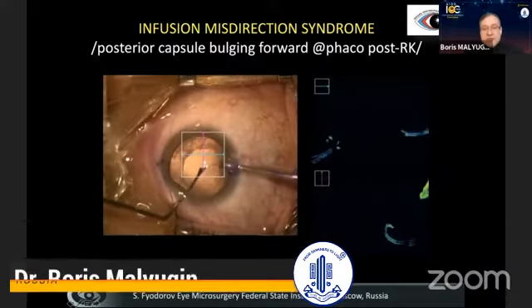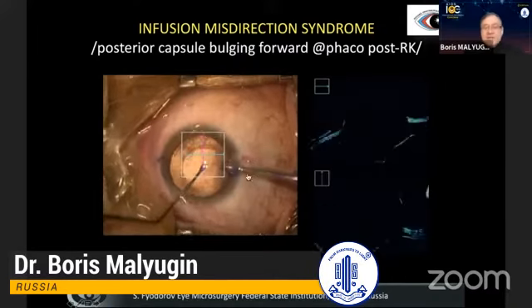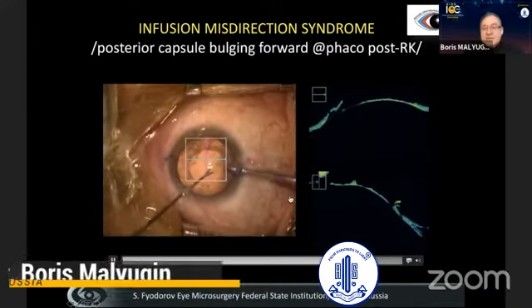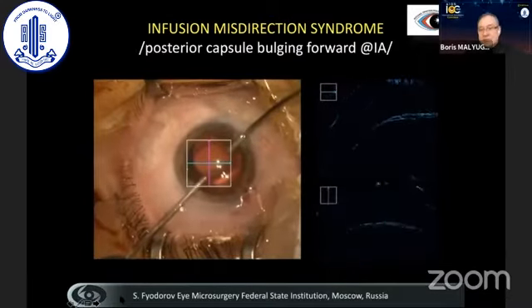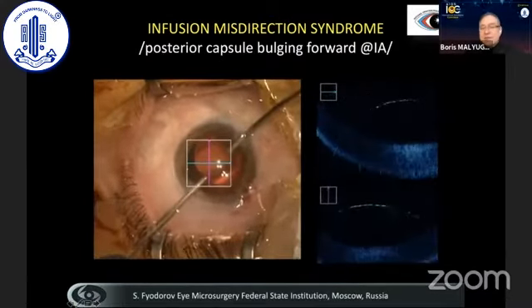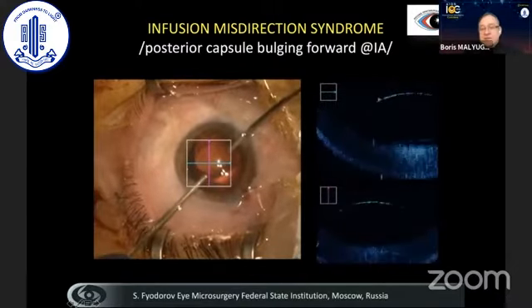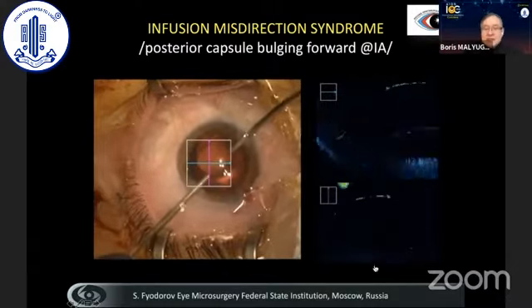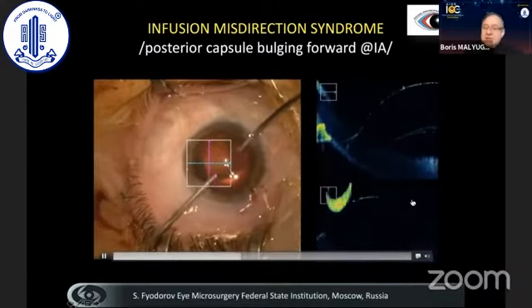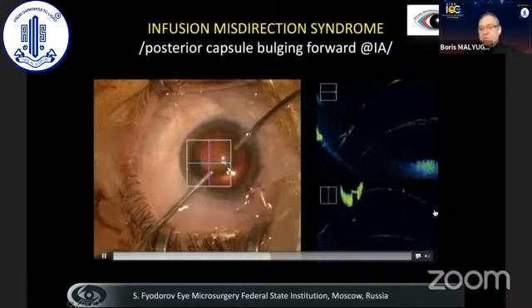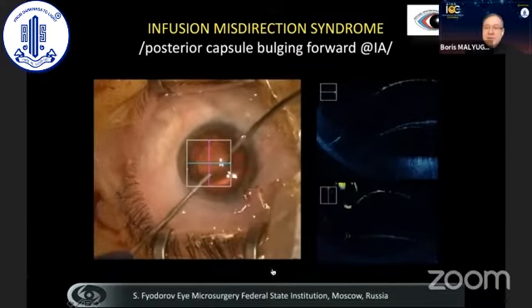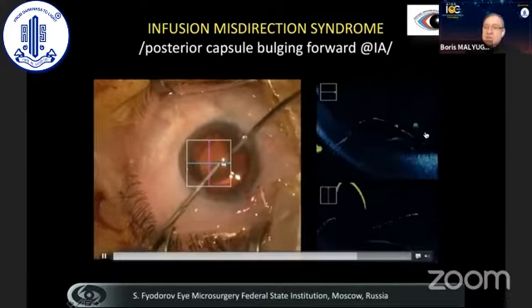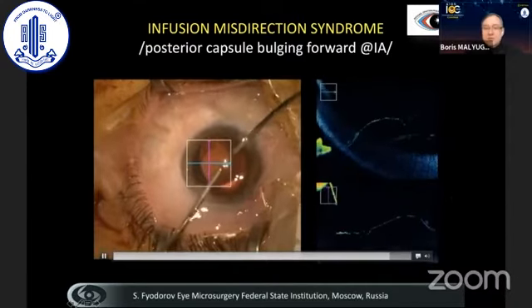This is again what happens when the anterior handpiece is in place and the surgeon is pushing on the capsule, showing that the pressure is quite strong and lifts the capsule. This happens not only during the phacoemulsification phase but also during the irrigation aspiration phase. Sometimes this bulging is quite prominent and significant, and we have to be aware of that in order to avoid aspirating the capsule. Again, you see the double image of the anterior hyaloid, which is split into two pieces.